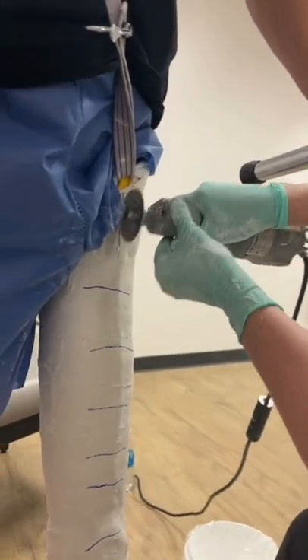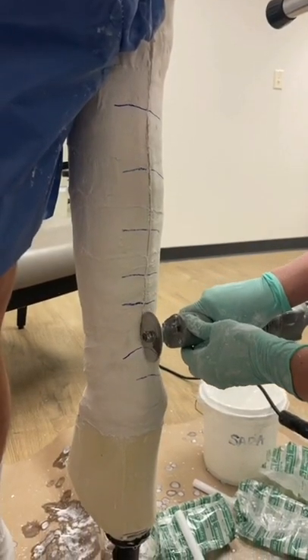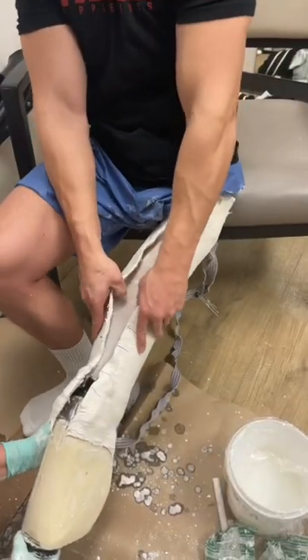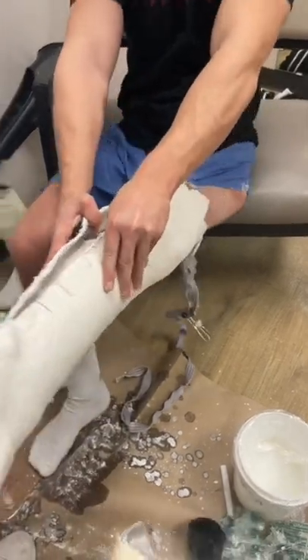Once the plaster is hardened, we cut the plaster with a little device here. We cut over that yellow guard so that way we don't cut my leg. Next, we finally free my leg from the plaster, and after that we have a solid foundation to build the top of my leg.